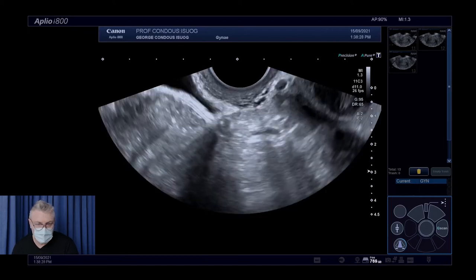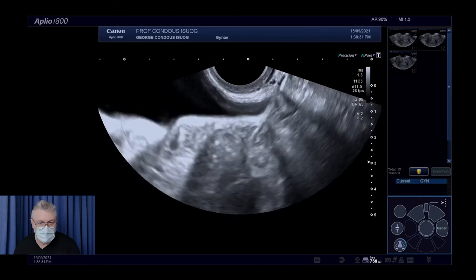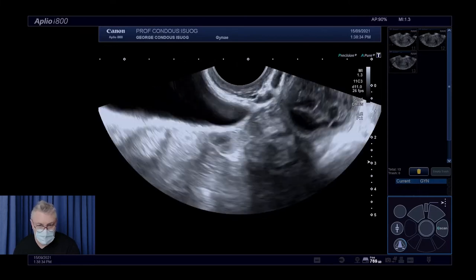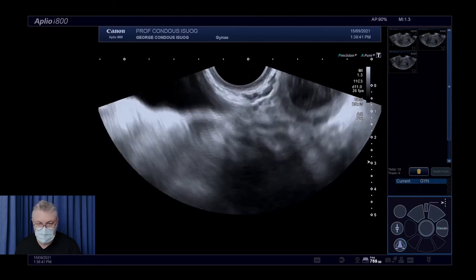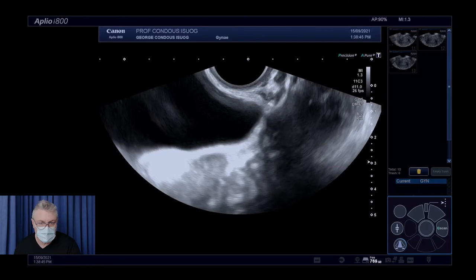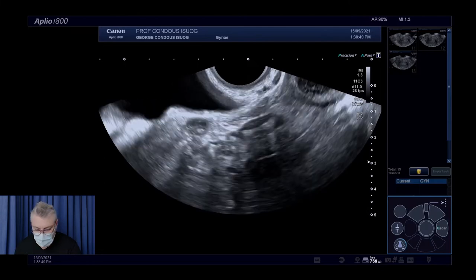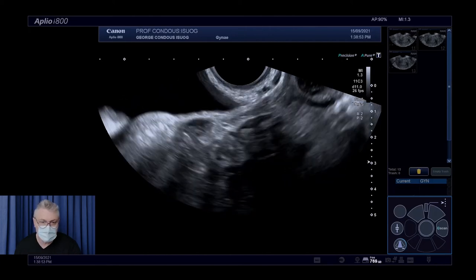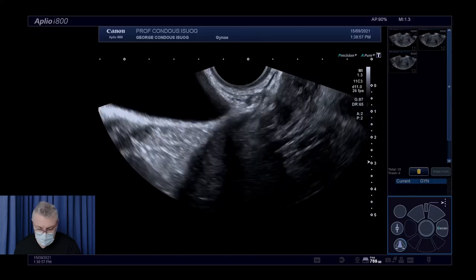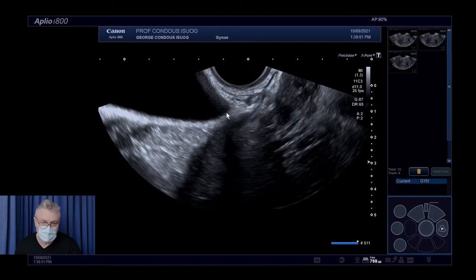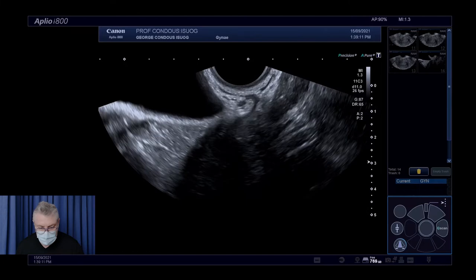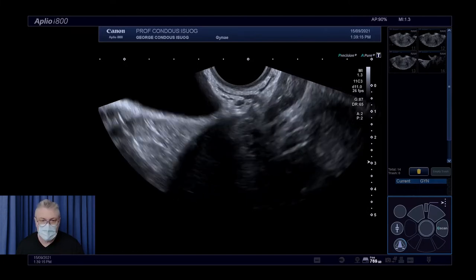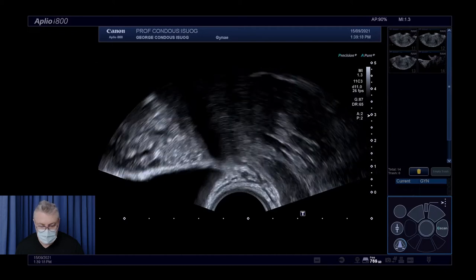We'll now look at the anterior compartment. I always get patients to empty their bladder before the scan, but ask them to have a cup of tea or coffee about an hour beforehand — the caffeine drives continued urine production and allows visualization of vermiculation within the ureters. The bladder base — the junction between the uterus and bladder and the most common site for bladder deep endometriosis — looks normal in this instance. We'll invert and reverse the screen to look specifically at the ureter.